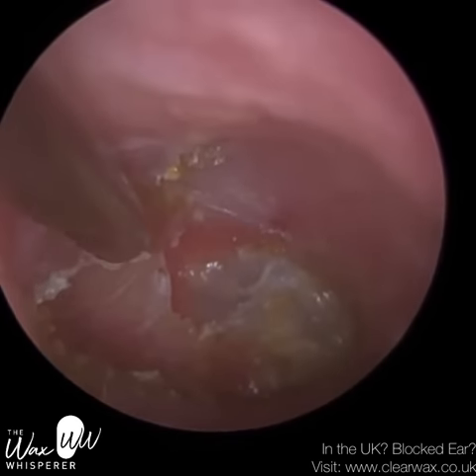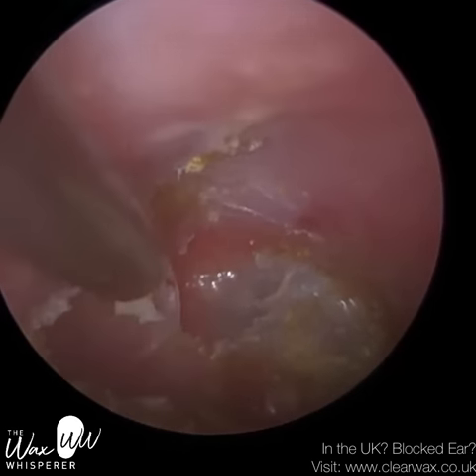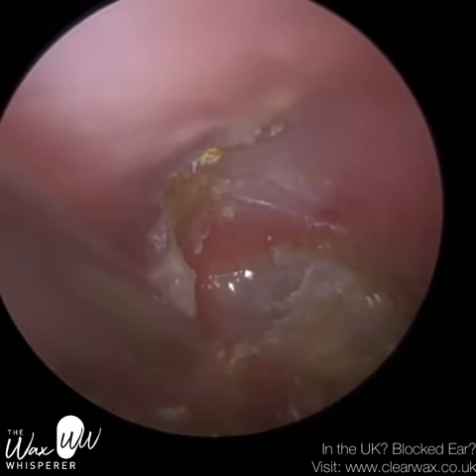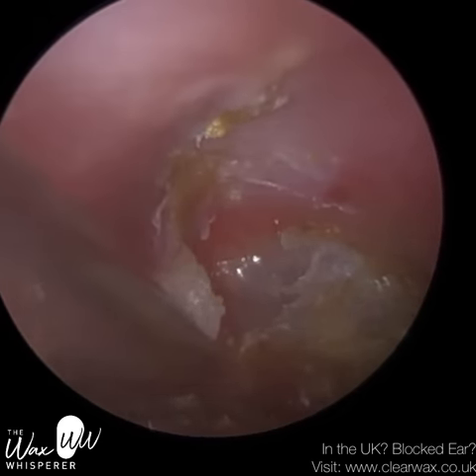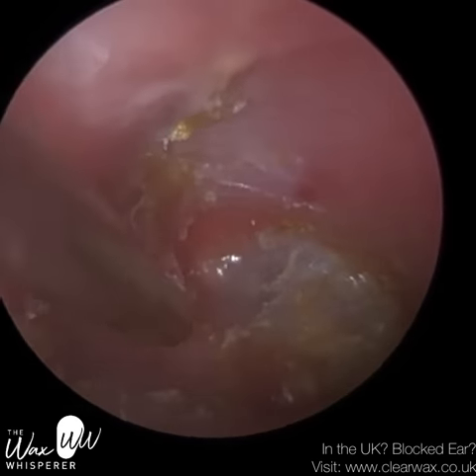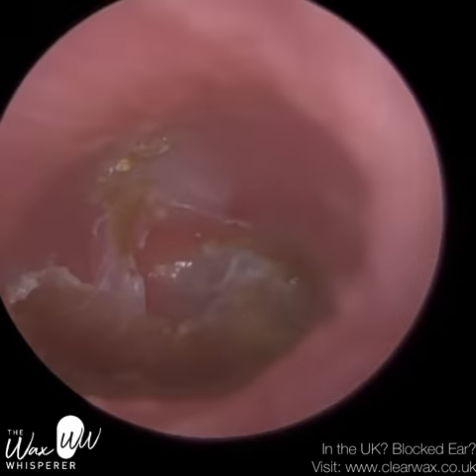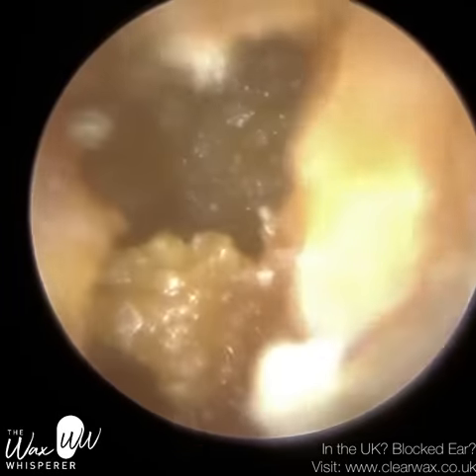I've just put some more drops in. I think we're more or less done now — I don't think I'm going to be able to get any more out, but the patient can hear much, much better and they're really happy. I'm continuing to try to remove material off the eardrum, but I've put so much pressure on already that any more and I'm going to risk going through the eardrum, and we obviously don't want that. Now that we've got this blockage out, this skin should hopefully just start to migrate away — previously it couldn't because of all the debris in front of it. Any more pressure on the drum will potentially perforate it, and that's the last thing we want.